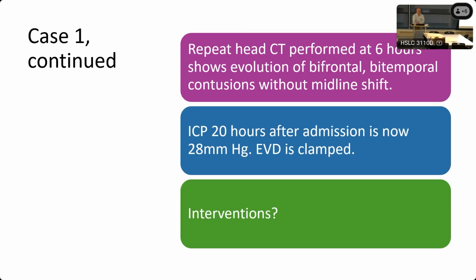Without a transducer, tell me how you do it. Anybody? When you use the word transducer, what is that supposed to be level with? I don't want to talk about the transducer right now. I just want to talk about how we're measuring pressure. Isn't it just how far up it is? So what's zero again? Atmosphere.